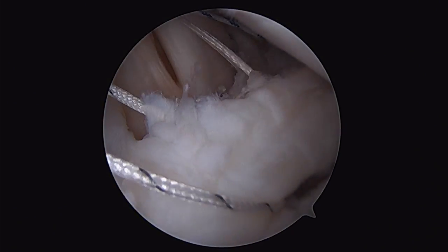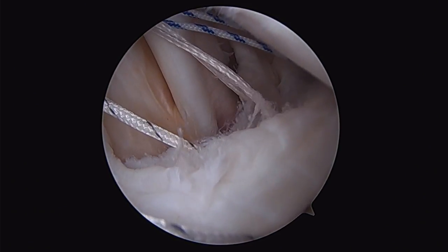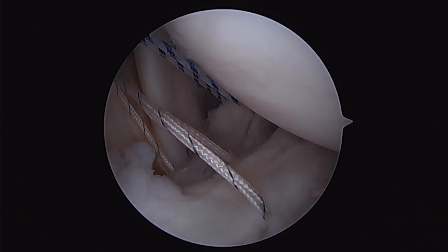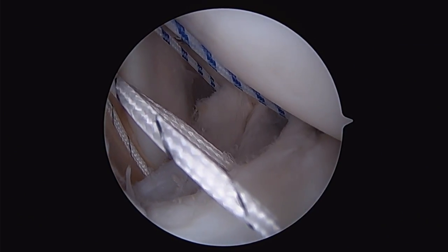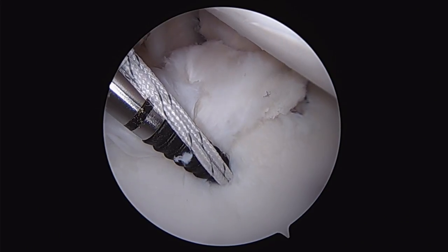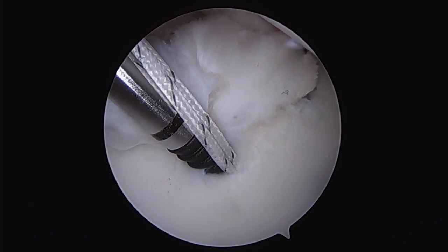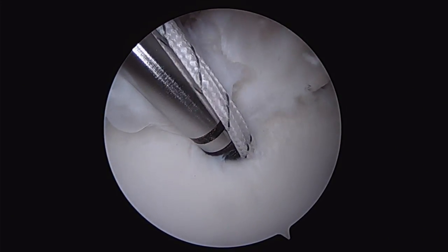The last suture being passed here will be secured with a 2.8mm knotless anchor, while we've tied our inferior sutures to give us a nice capsular shift, before deploying our 2.8mm anchor to complete our anterior repair.